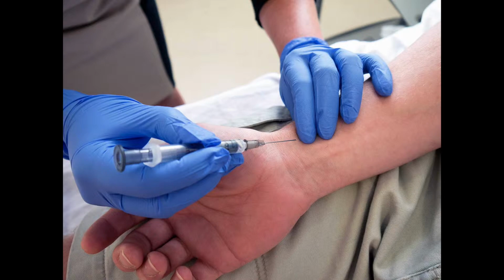Contraindications of the use of a specific site, however, may include occlusion of the vasculature previous to your attempts of artery puncture, infection, the inability to compress the site after you've performed arterial puncture, and signs of a lack of collateral circulation to the distal tissue.